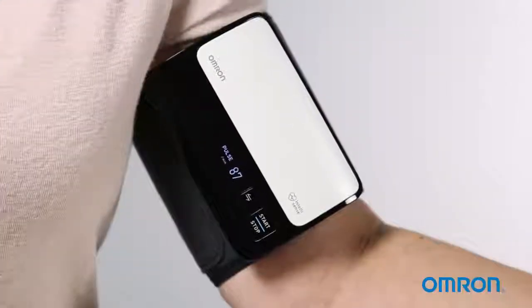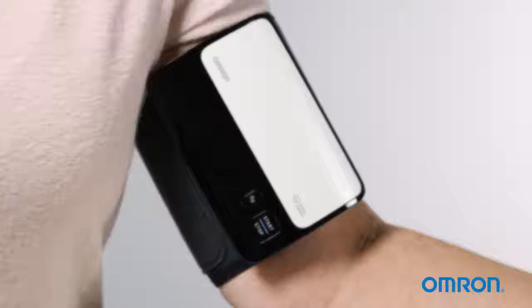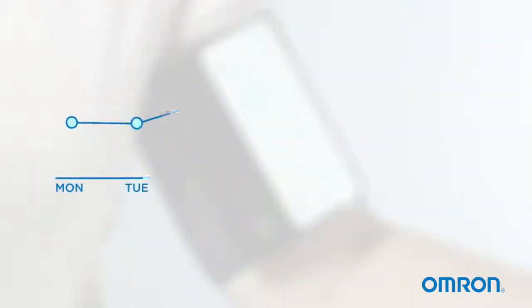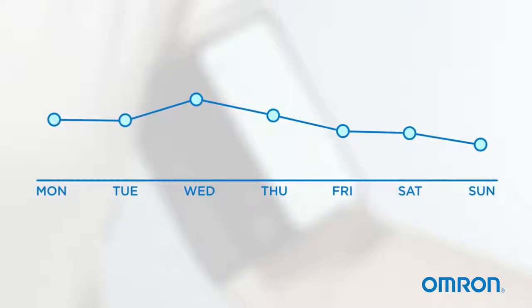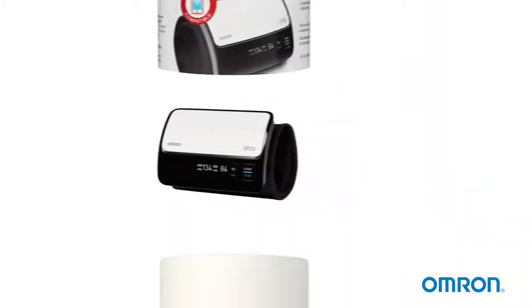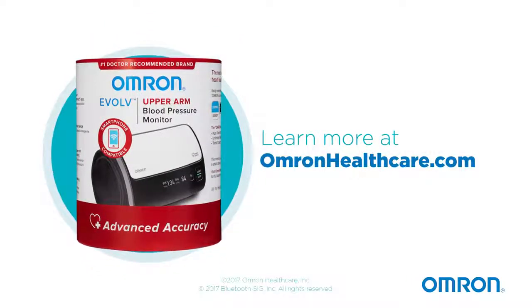When you're done, press the start-stop button to turn off your monitor. It's important to take measurements at the same time each day and use averages over time to compare your readings. Be sure to follow all instructions provided with your Evolve upper arm blood pressure monitor. Learn more at OmronHealthcare.com.